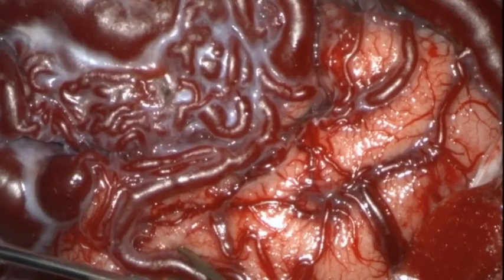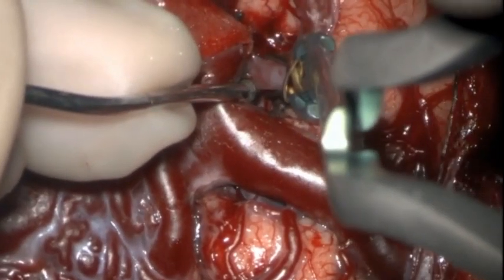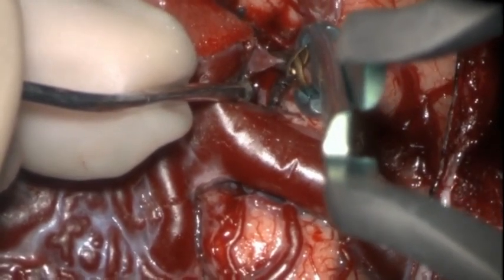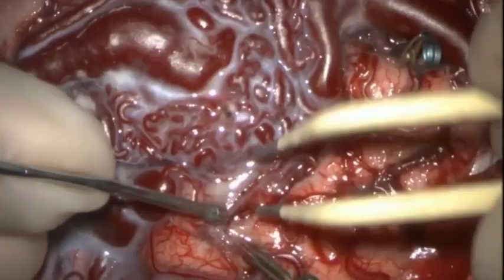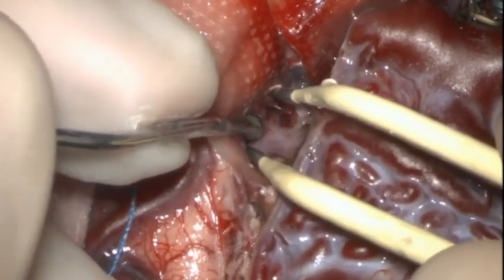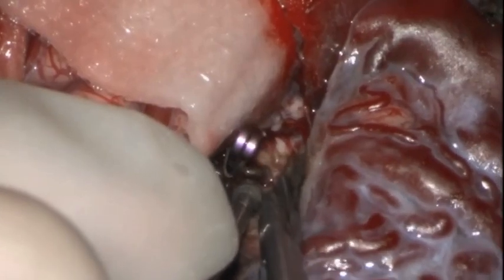As the dissection continues and the draining veins are identified, arterial supply is then identified and ligated. Larger vessels can be taken with aneurysm clips, while smaller vessels can be sacrificed with bipolar cautery. Feeding arteries for these AVMs may arise from branches off the parietal occipital artery and from the P4 segment of the PCA. When there is a question of whether a vessel is a vein or an artery, a temporary clip can be applied. If pulsations dampen away from the AVM, it is a vein and must be preserved.